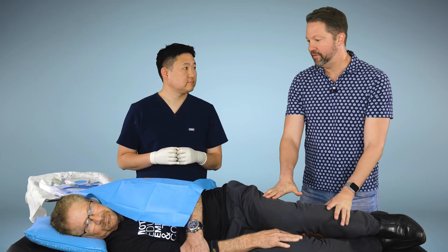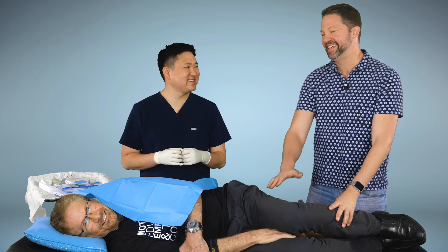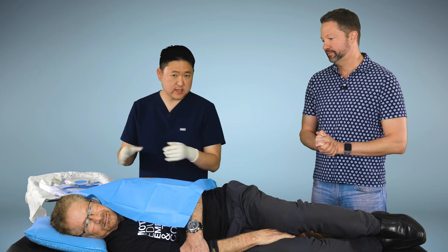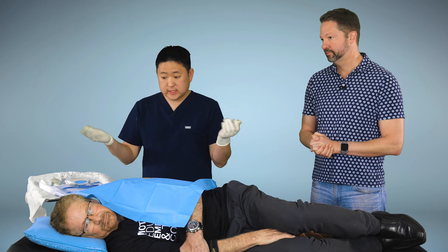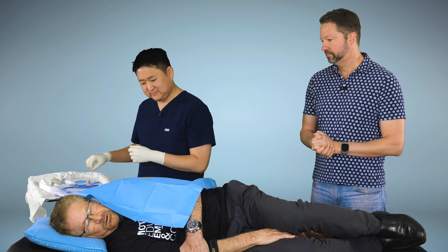David is the expert on actually doing the procedure, Steve is going to be getting it implanted, and I will be color commentary — mostly supporting Steve but also making fun of him when appropriate. We are back, Steve is on the table — this is not a stunt double. First we mark the area where we're going to put the sensor, then we created a sterile field with this drape, and next we're going to get started with the procedure by using lidocaine to numb the area.